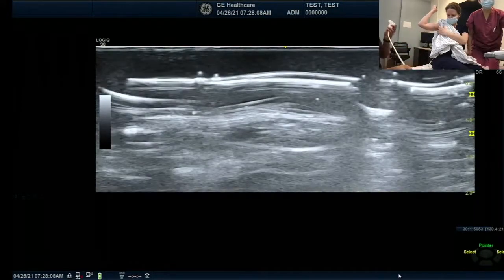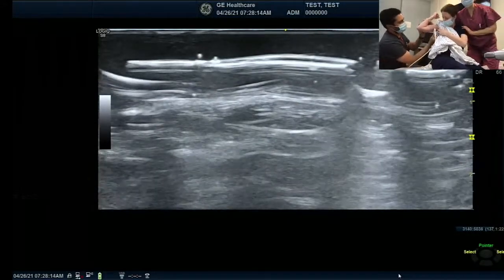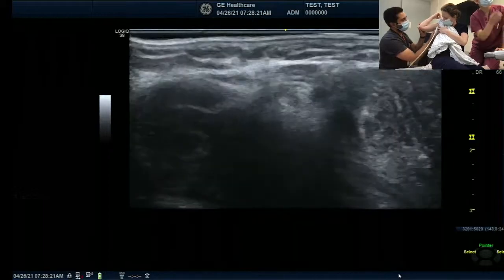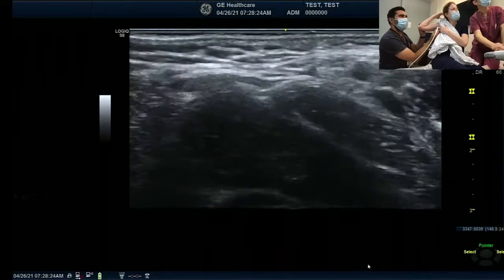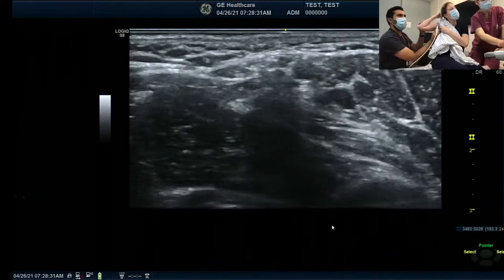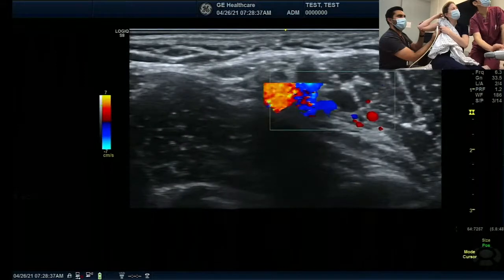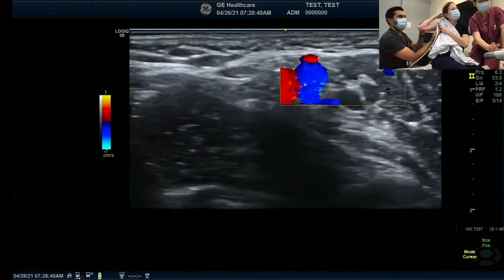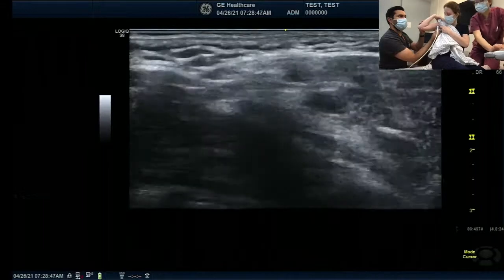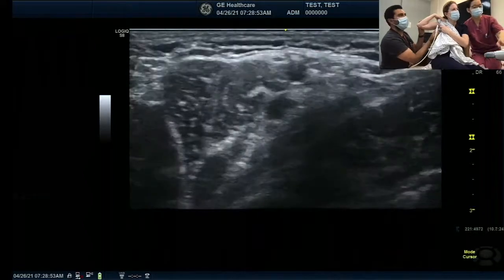So Divas is going to start from the axillary artery area. Come, yeah. So let's start like this. I'm going to change the depth a little bit, and then color flow. Ah, look at that. Oh my goodness. Hers are very proximal. Okay. Then I'm going to get rid of that. Can you flip over so people won't confuse the direction? Yeah. We're going to use the same direction because otherwise everybody will be confused.